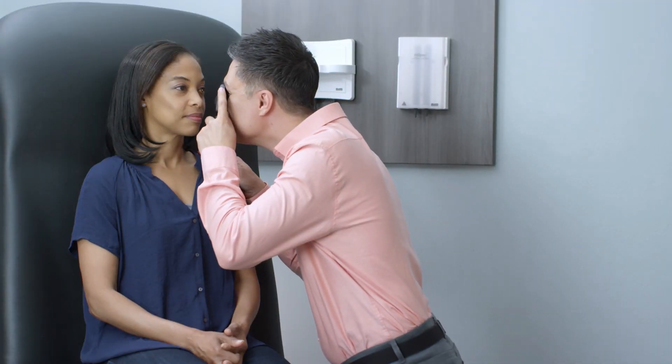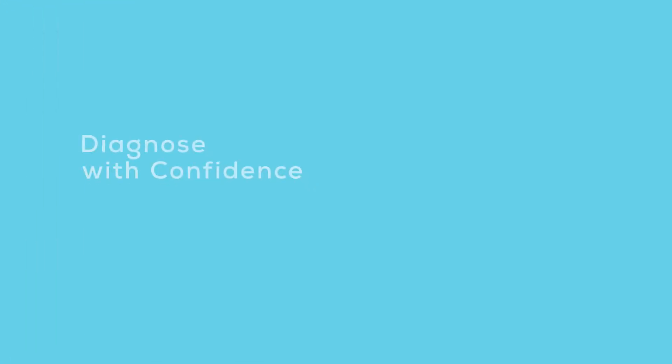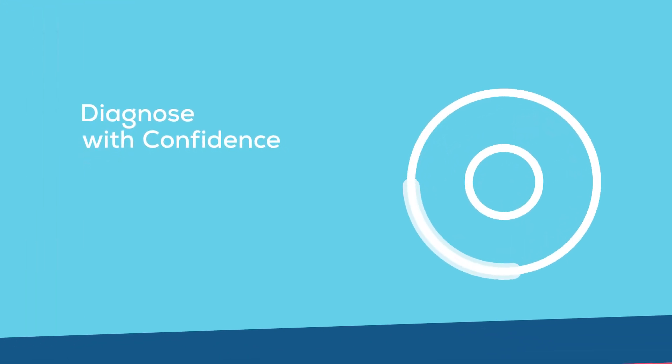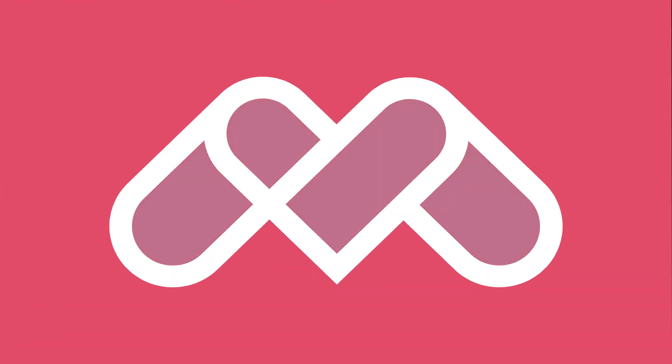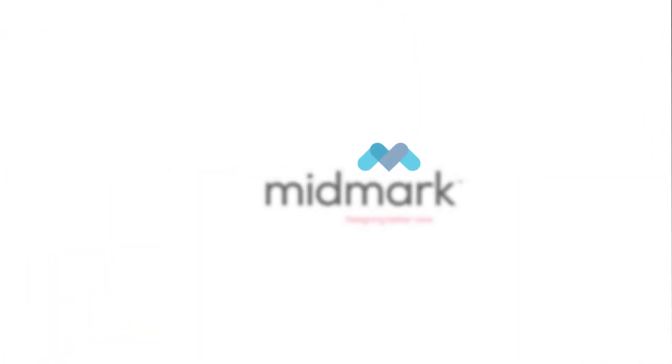By incorporating the latest diagnostic device technologies into your workflow and utilizing their features properly, you'll obtain a more reliable, accurate physical examination and ultimately be able to better diagnose with confidence. The Beta 200 ophthalmoscope — exclusively from Midmark and Heine.